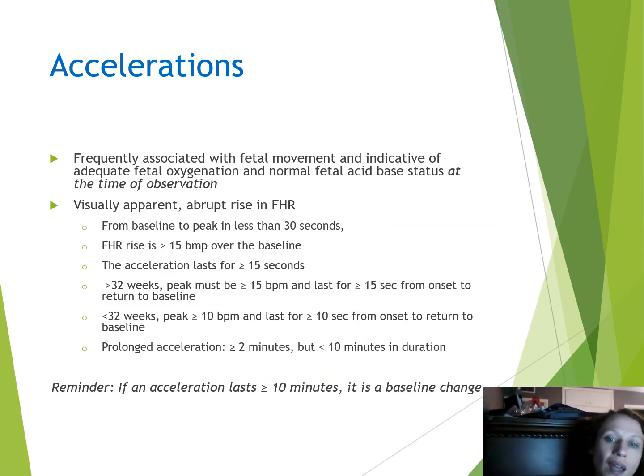Accelerations. Accelerations are when we have the fetal heart rate jump 15 beats per minute for 15 seconds over the baseline. So you have your baseline, like 125, and then it goes up to 140, okay? It does not have to be up to 140 for the whole 15 seconds, but that jump has to last for 15 seconds, okay? If they're greater than 32 weeks, that's how we count accelerations. If they're less than 32 weeks, 32 weeks is kind of our line.